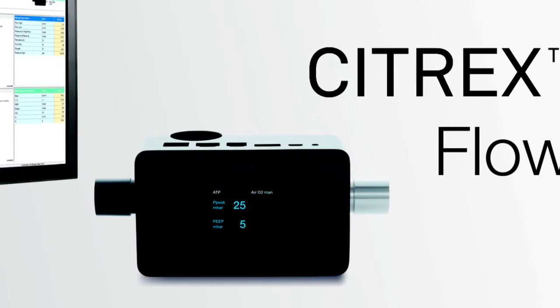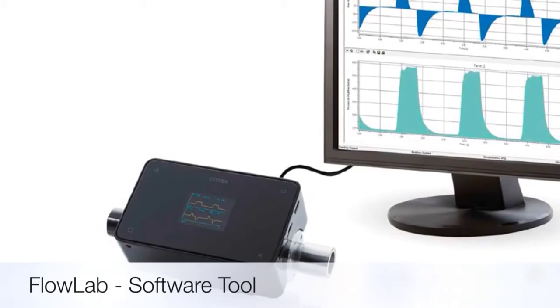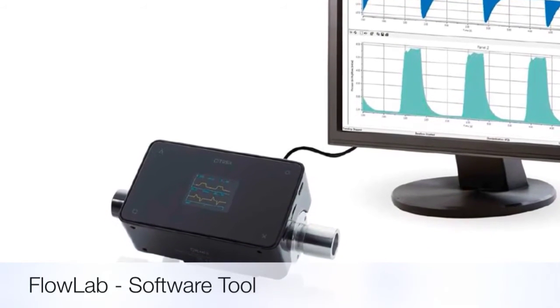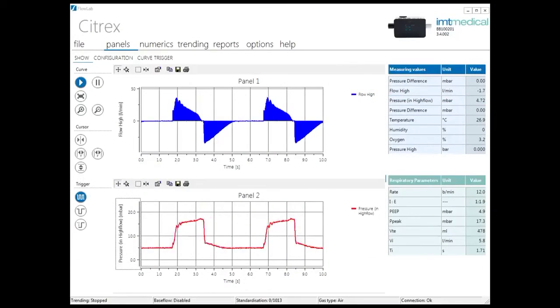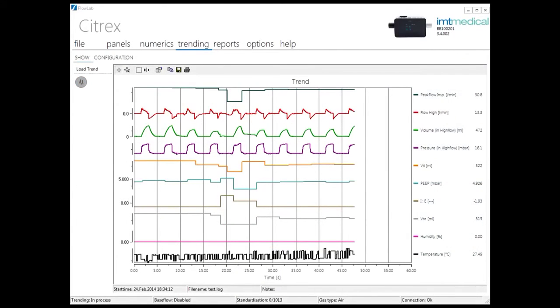Flowlab is an advanced software tool for detailed analysis and reporting of all Citrex parameters. High resolution real-time curves, trending capabilities and advanced reporting functions make it indispensable for specialists.